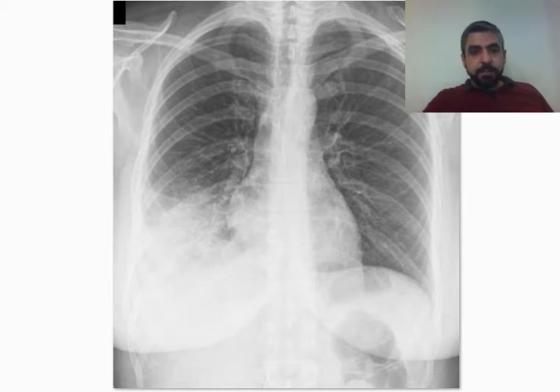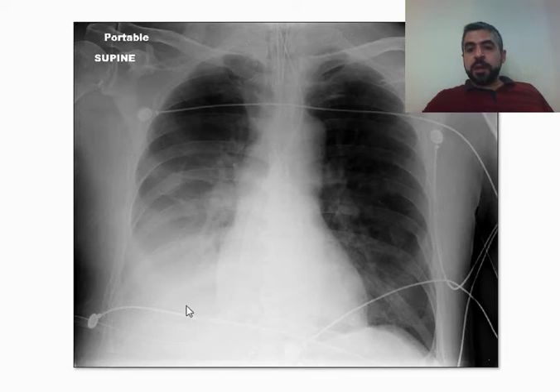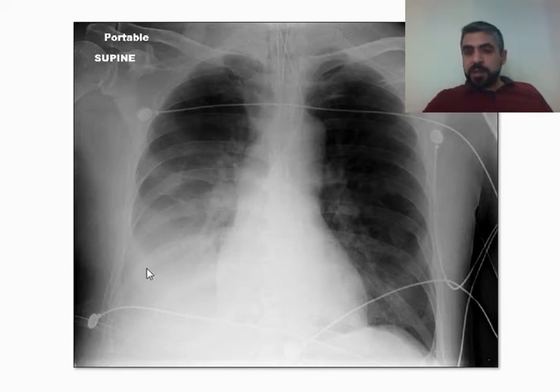A few more examples. The right hemidiaphragm is not seen, the right cardiac border is obvious — this indicates a right lower lobe consolidation.